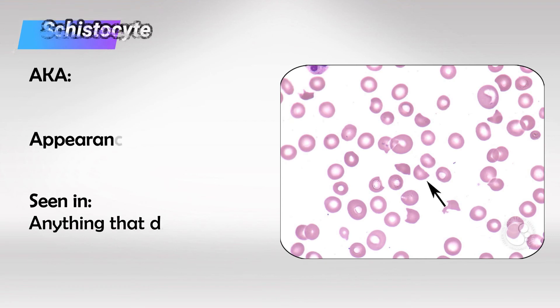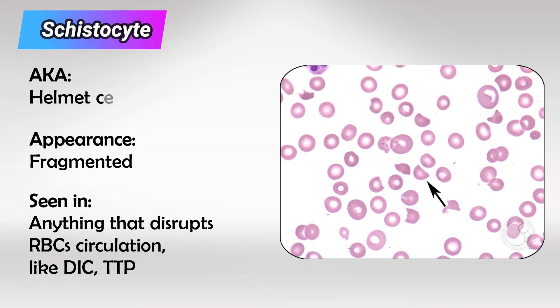Next we have schistocytes, and these are commonly referred to as helmet cells. These are basically broken RBCs. We see these fragments in many diseases — basically everything that can destruct RBCs.